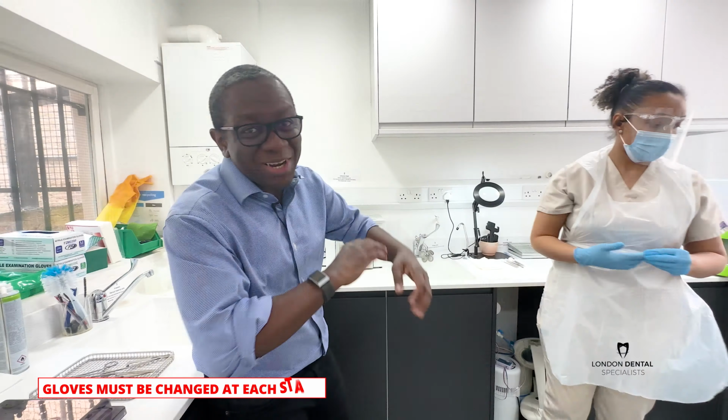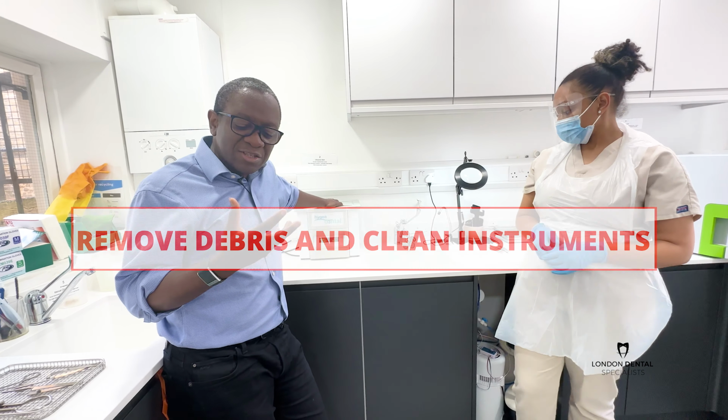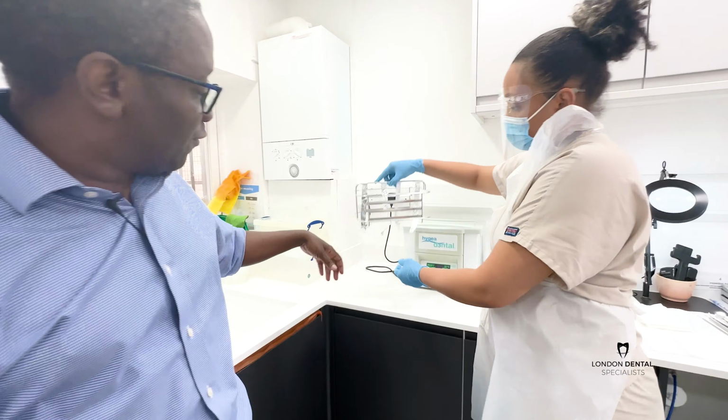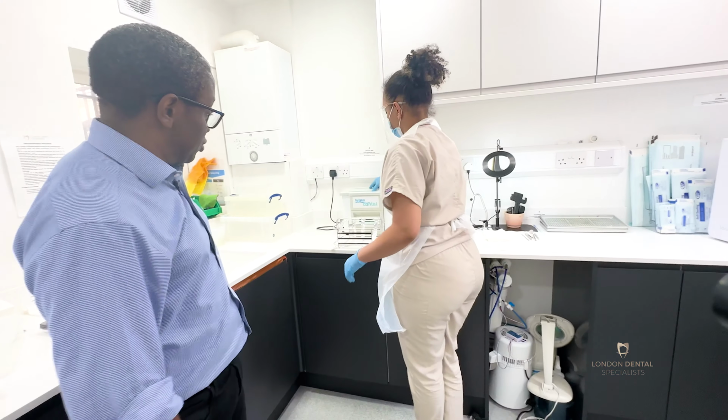The other way we ensure that the ultrasonic machine really does what it is supposed to do is to do what is called a foil ablation test. So we start with pieces of foil that look something like that, okay? They're just any kind of foil that you have at home. And what we're expecting is for the ultrasonic waves inside the machine to actually damage the foil and destroy part of it. And you can see that we start with strips of foil that have straight edges, like that. And you can see there that the edges have been damaged.